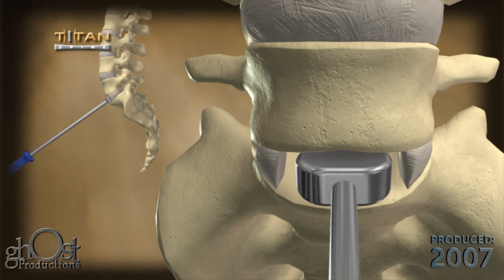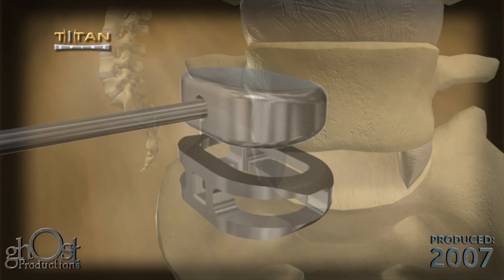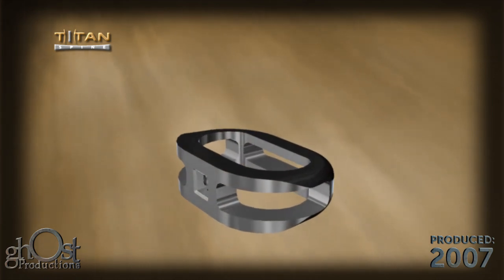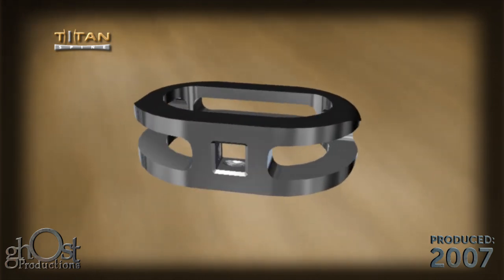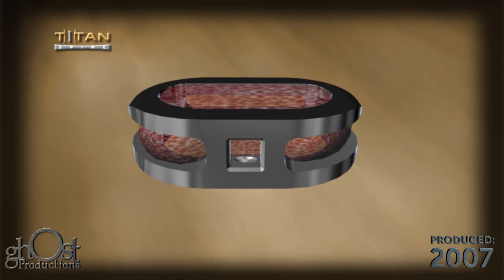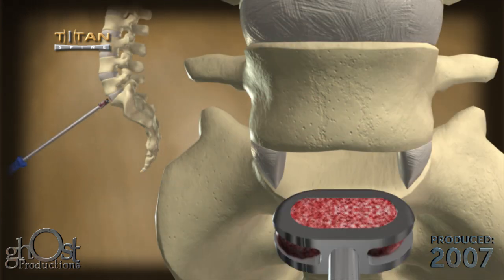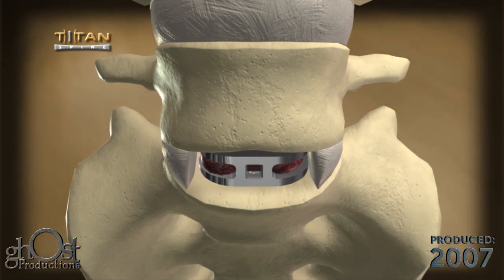Use the endoskeleton implant that matches the size of the final distractor. If a tighter fit is desired, the implant may be upsized by 1mm in height. Pack the implant with bone graft or bone graft substitute material. The endoskeleton is then easily inserted under fluoroscopic visualization.